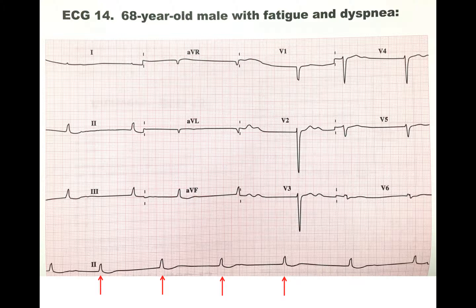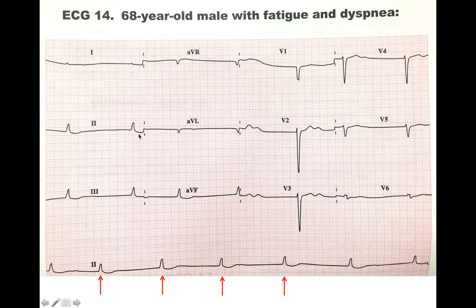Some things we look for in digitalis toxicity: digitalis is a drug that basically cuts off the AV node, and so it causes something like a complete heart block. Characteristic things to look for are sagging ST segment depressions, which you can see in lead 2 right here — it's like a little smiley face — and here as well. Another thing to look for is decreased T wave amplitude, seen here and in V3 and AVF.